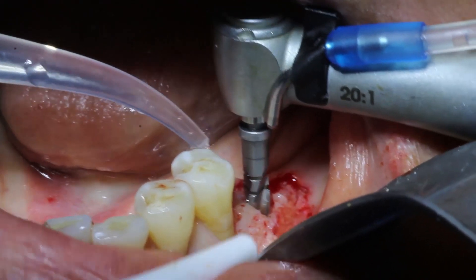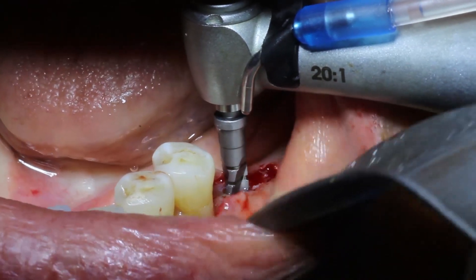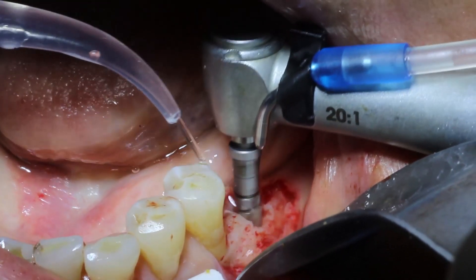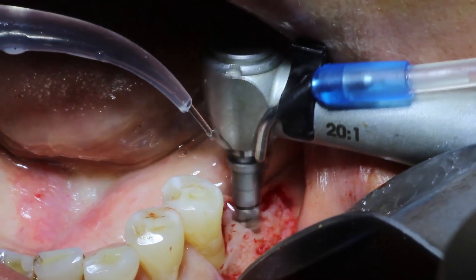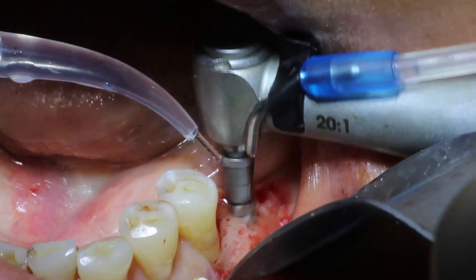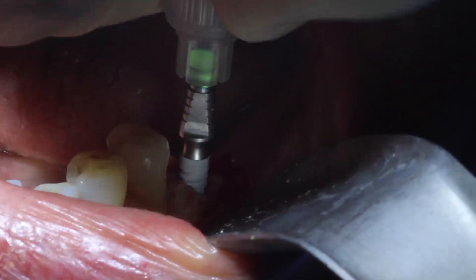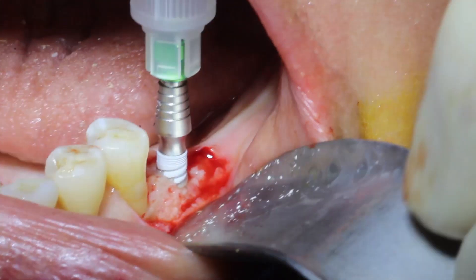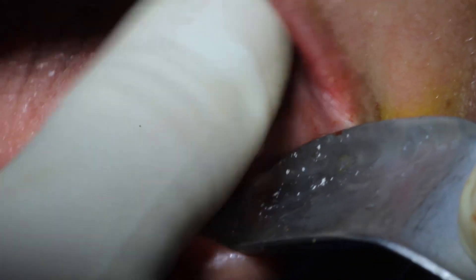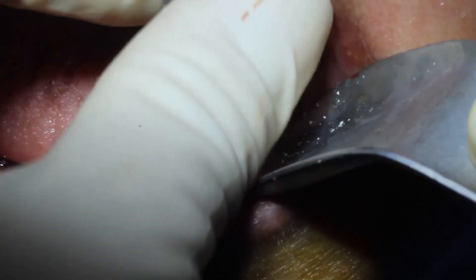I just ran out of irrigation on my handpiece, so now we have to squirt with a Monoject syringe — that's why you see me pausing. My preparations are just about done and now I'm going to go ahead and place my implant. This is an eight millimeter implant. I'm placing it with my fingers first using the convenient little finger grip for initial tightening, and then once it's really tight that plastic part just pops off and I do the rest of the insertion with my hand driver.